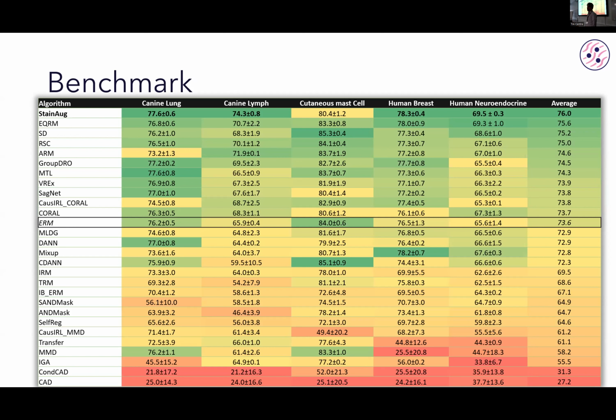So this augmentation can be really effective. This is actually what we found in another work that I've done in mitosis detection. I didn't investigate this much, but I investigated about 5 different domain generalization methods for mitosis segmentation, and stain augmentation worked better than all of them.